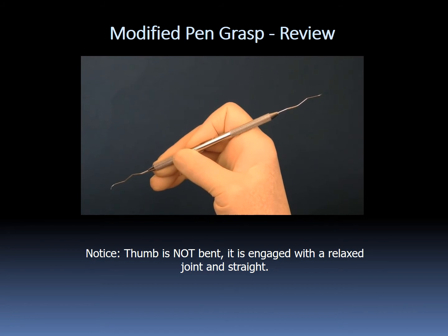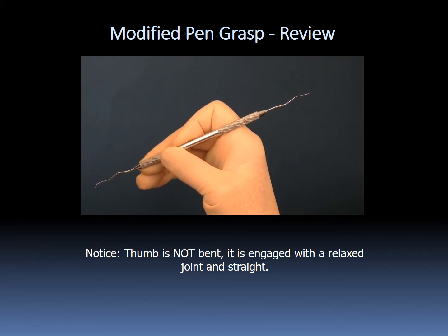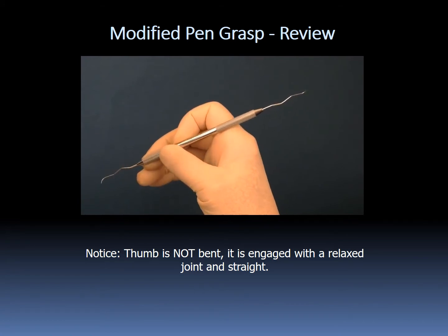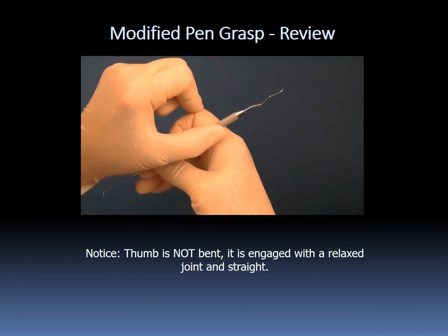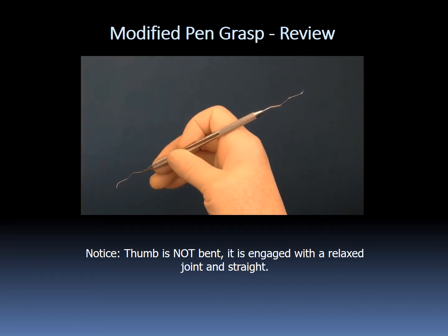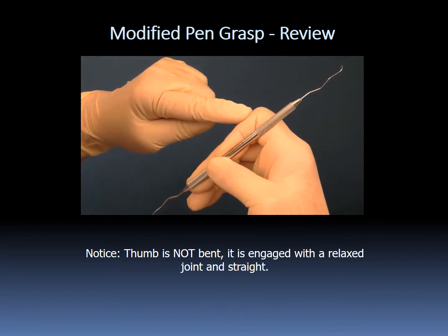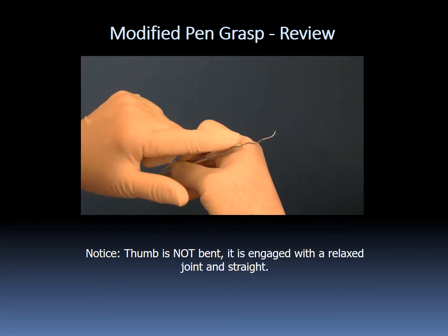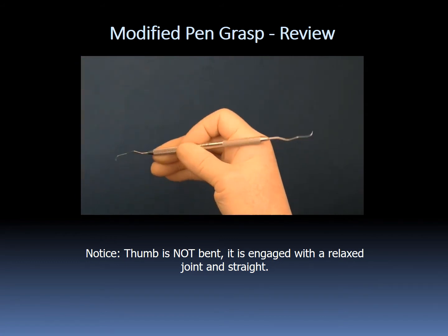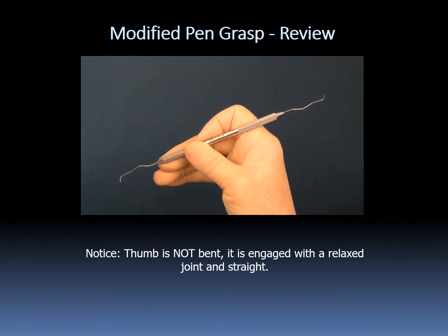You don't want to hold it with a really tight death grip, because that will make it difficult to detect calculus. So sometimes you're going to be using a moderately firm grasp like this, and sometimes you may wish to relax it to get a lighter touch. This instrument, the Explorer handle, is going to rest here between these two joints most of the time. And then again on the anteriors, it's going to be up high, close to this joint. And when you get to the posterior areas, it's going to go down a little further. Usually you don't want to go past the bone on this part of your hand, though. So this is the modified pen grasp for the ODU 1112 Explorer.